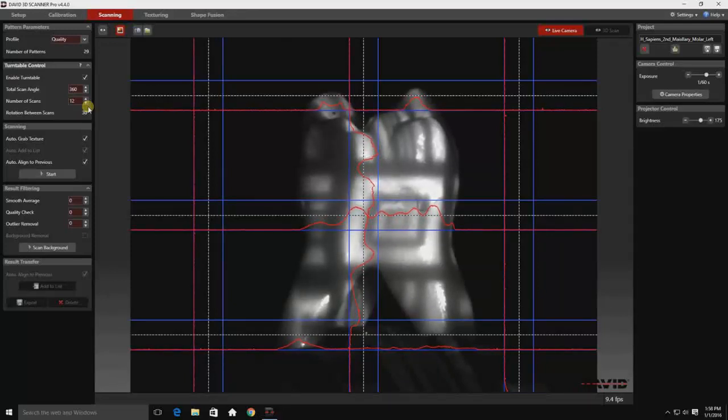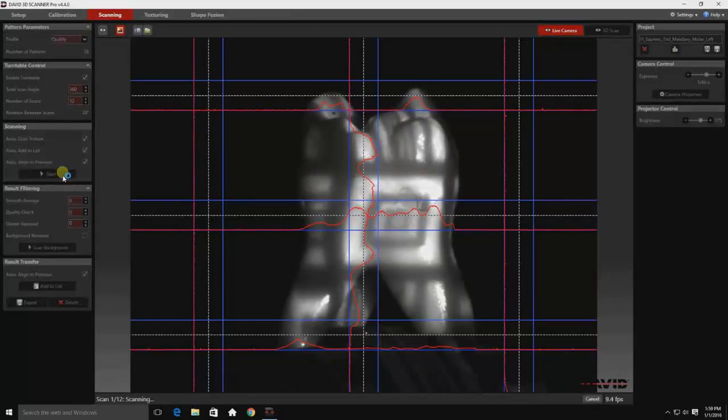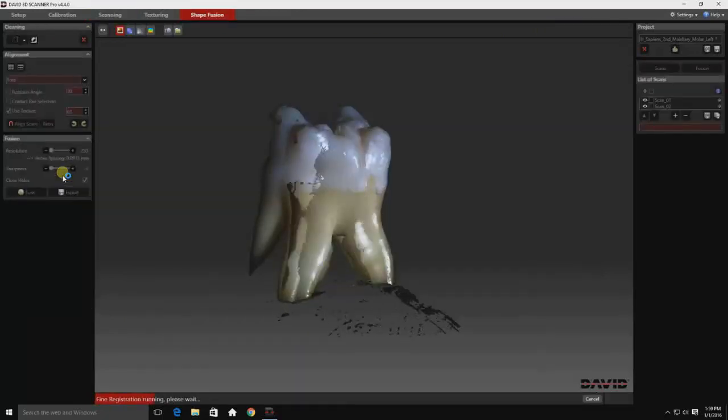So I typically set my number of scans at 12 for a 360 degree rotation with the turntable, and at this point we are ready to start. It'll take some time to move through all 12 of these scans. Now you see the computer working on lining up the scans to each other, and you see it beginning to build the tooth model.